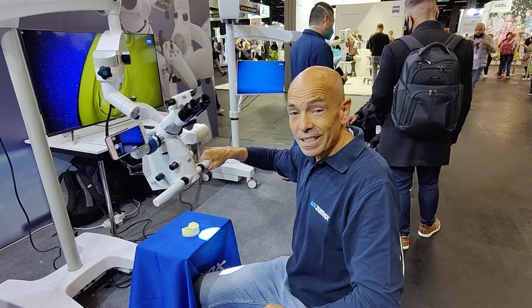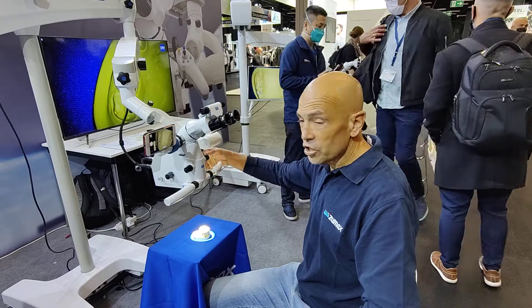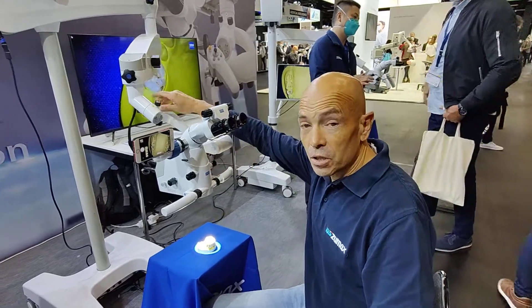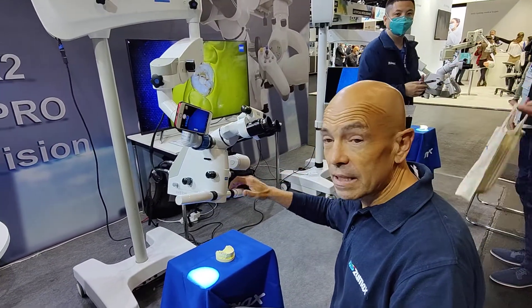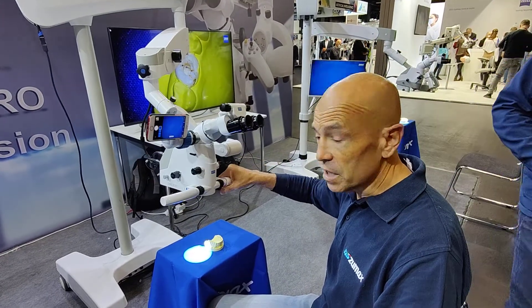A very good feature of this machine is that it's very easy to handle. You can adjust the arms so that it's easy, and at the same time you can put it in the position that you like to work and it stays, moving very easily.